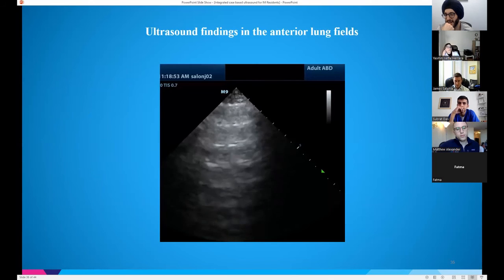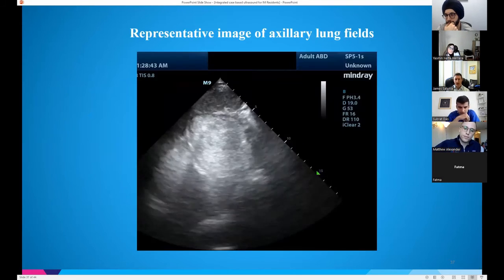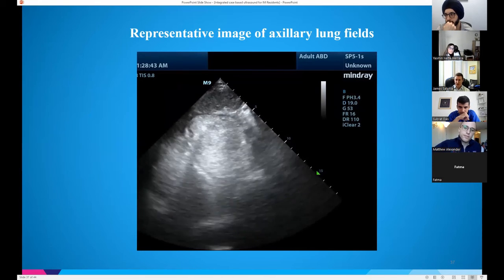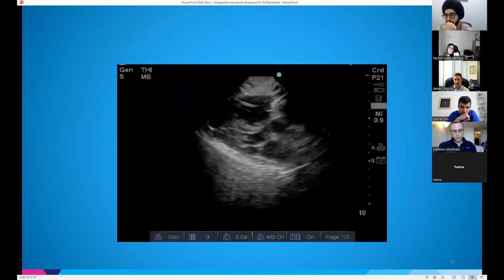So we go down, we see the patient. We take a look here, and what do we see? A profile. Excellent. A profile bilaterally. Let's look at the axillary regions. What do we see? The curtain sign. Your favorite, the curtain sign. You guys have now seen it twice, so everybody should be going crazy.